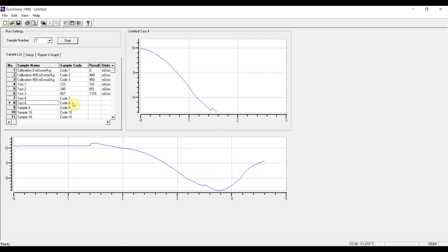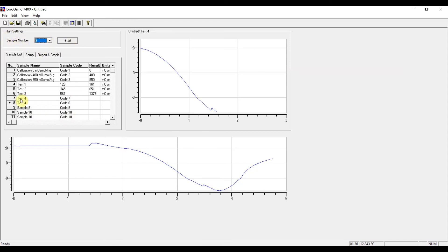But then in that case, you have to remember to change the sample number up here and start the measurement again. Otherwise this line will be overwritten.